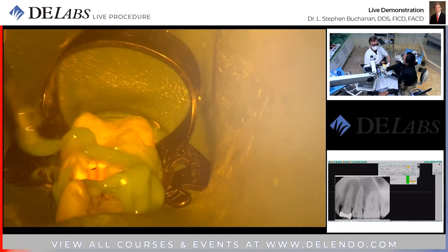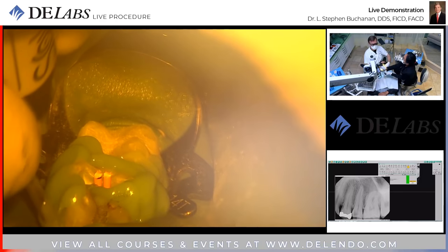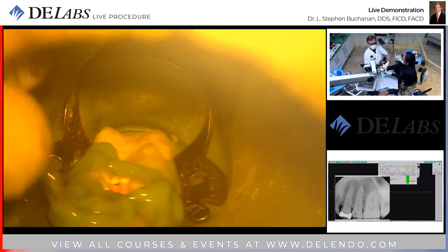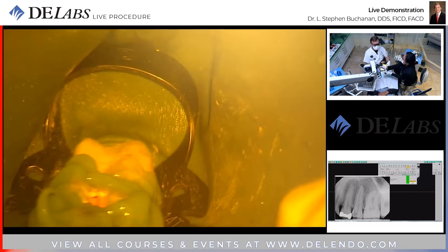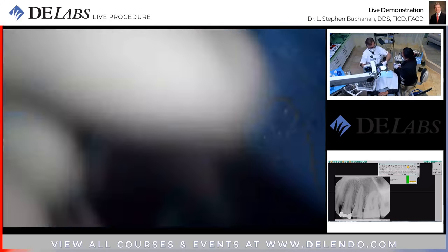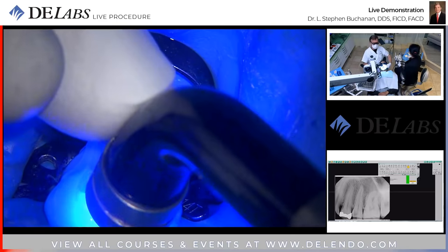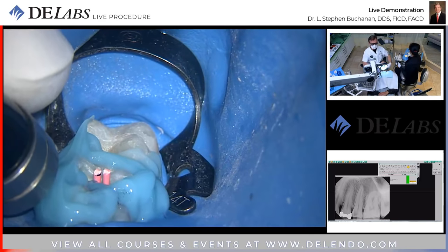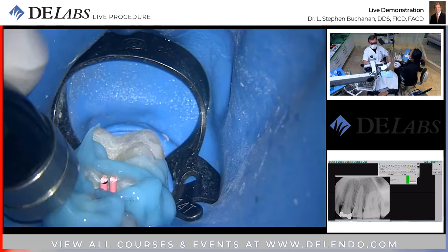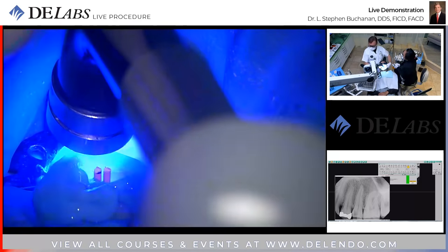I use this stuff liberally. You really don't want to have to remake a platform if you don't have to. Okay, let me even this out a little bit. She's going to take that filter off, and I'm going to light cure it with my handy-dandy plasma arc curing wand. This is a DenMat tool. I love this tool. There's nothing more like eternity than waiting for light curing to happen. So this will do it in at least half the time, sometimes a third of the time.